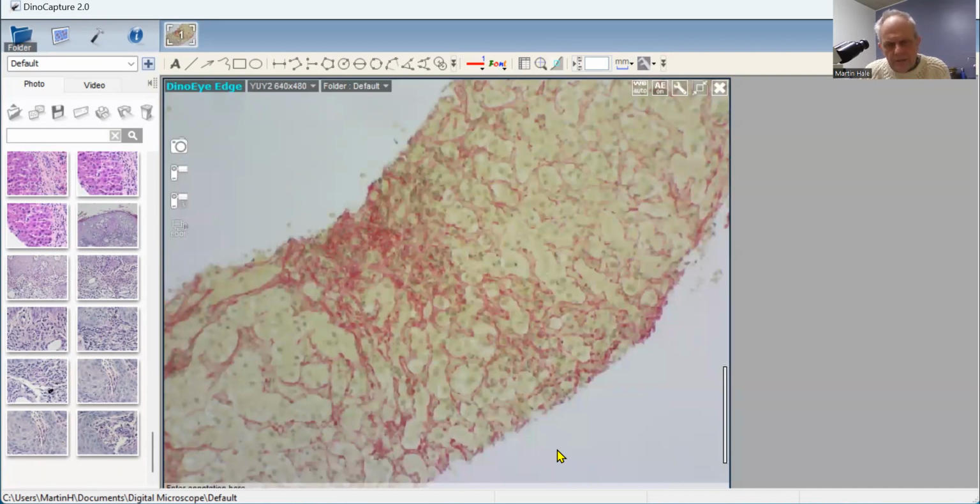So I think there are a few subtle features here that support a diagnosis of autoimmune hepatitis. I think it has been modified to a certain extent by the previous steroid therapy. We haven't reviewed the previous biopsy. That's something that we probably need to have a look at to assess the intensity of the plasma cell infiltrate. But interestingly enough, neutrophils were also reported in that particular biopsy. So it looks like it's autoimmune hepatitis with ethanol-induced liver injury as well.